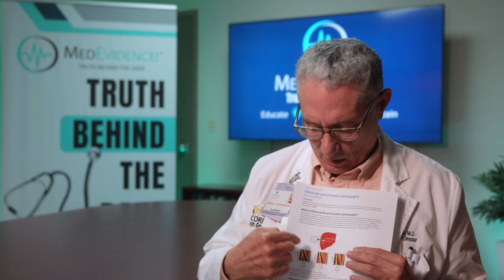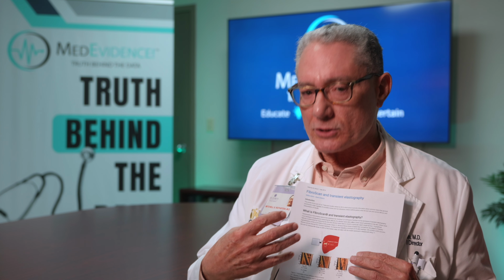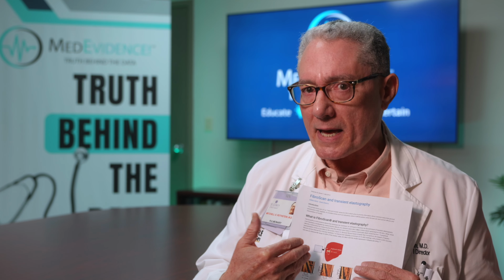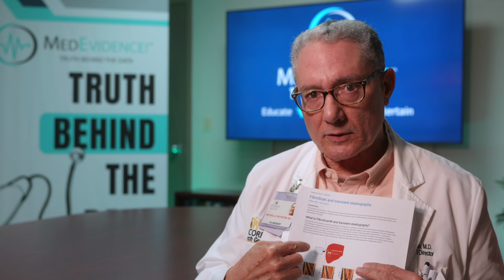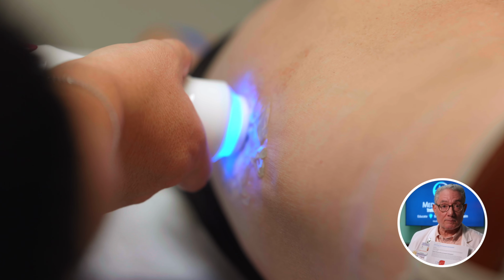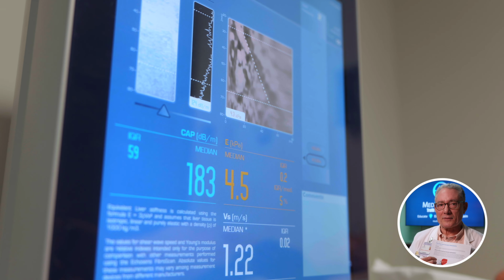The other aspect of the waveform that we look at is how much of the waveform comes back. Fat is known to absorb waveforms, so as the liver becomes fattier, less and less of the waveform comes back because more and more is absorbed. Those two measurements, the stiffness of the liver and the fatty content of the liver, are what's expressed on the probe, which you'll see in just a minute. We had a patient and a technician who were nice enough to be part of this podcast video, and we'll show you how that actually works.